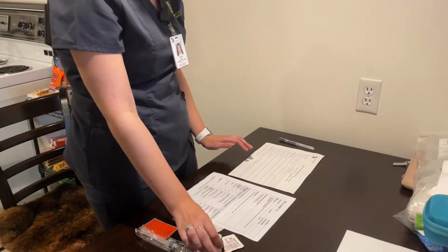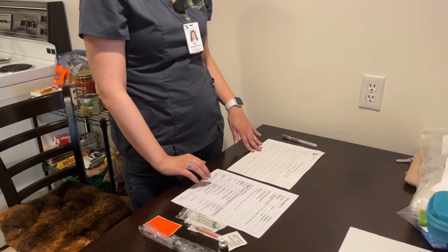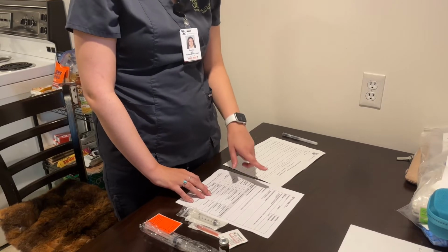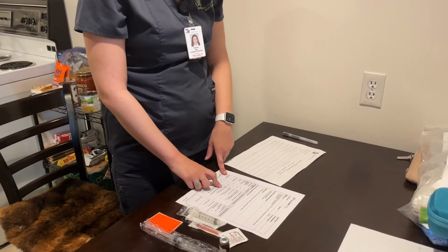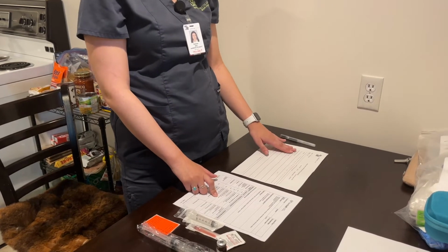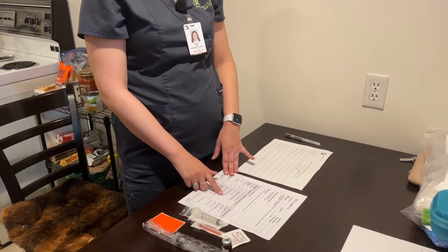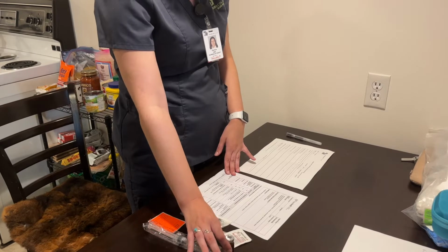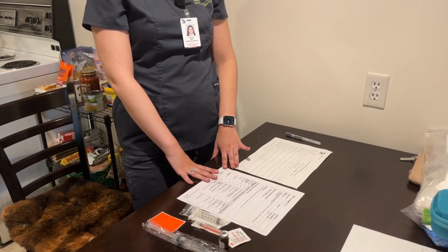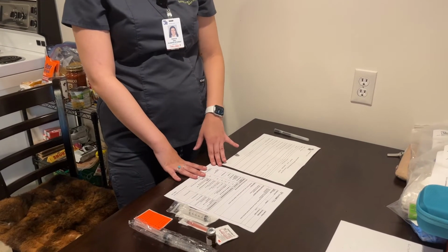So I'm also going to grab the PDTM just to make sure I am doing it right. So we're giving it IV direct. It is compatible with normal saline, and it is 40 mg per minute. So the dose is 40 mg, and I'm going to be giving 4 mils of furosemide because it is 10 mg per mil, so that's 4 mils. And my Q 15 seconds is I will be giving 1 ml per Q 15 seconds.